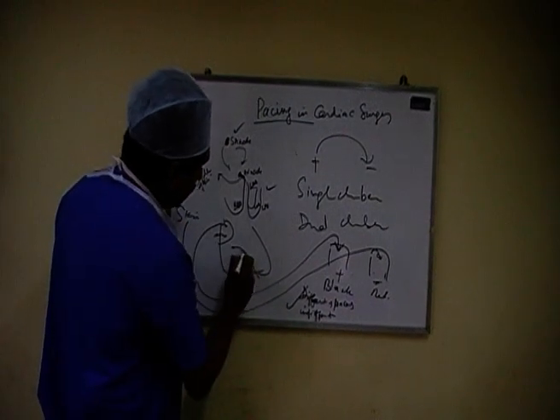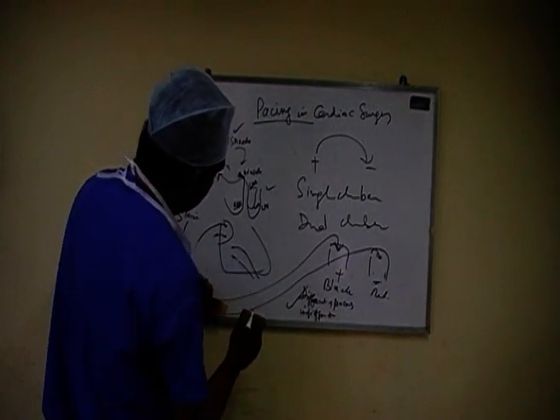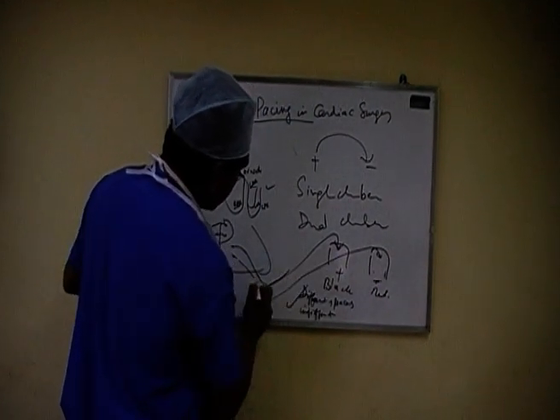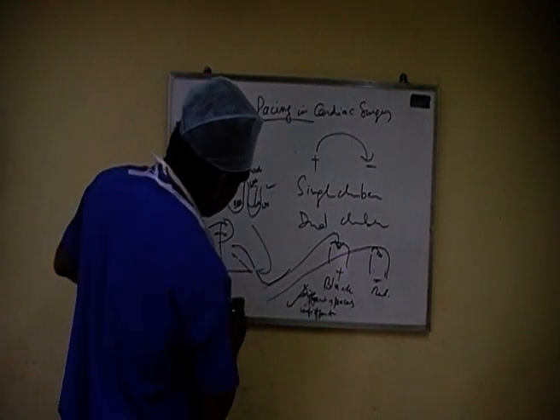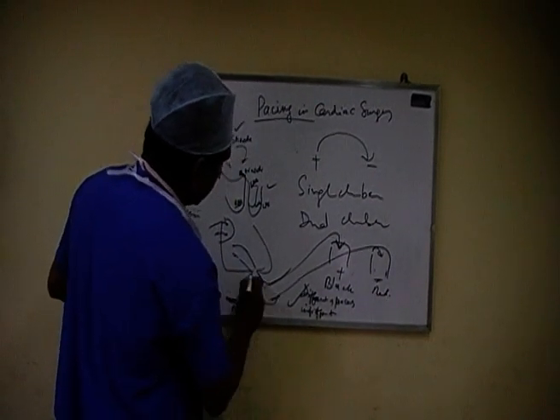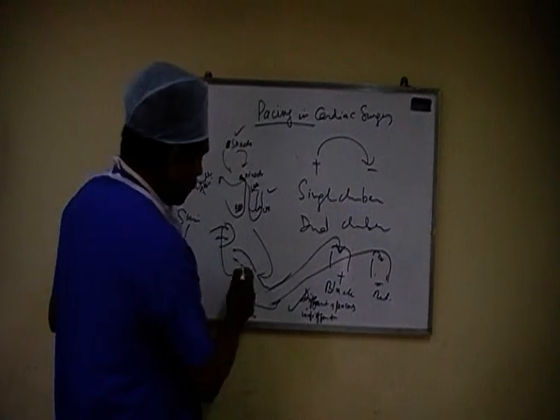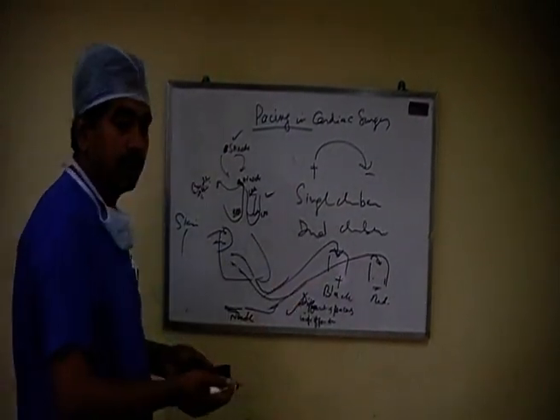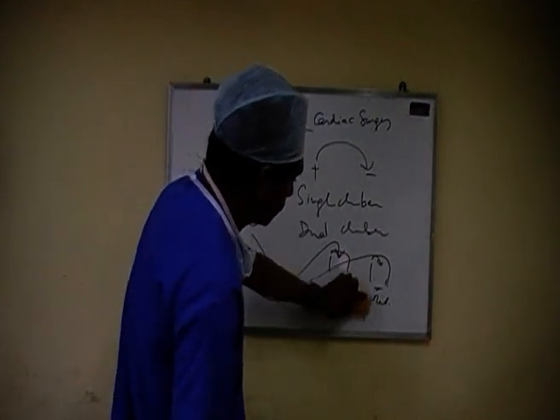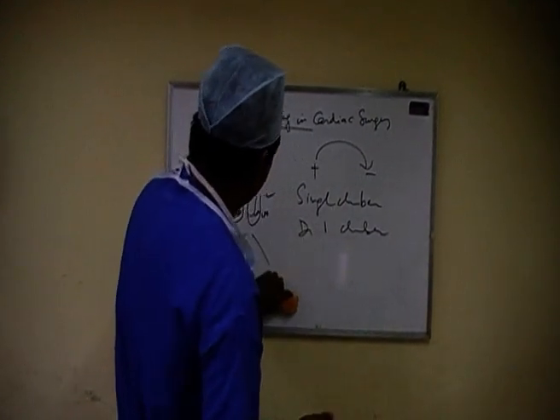If we are having VVI, then there is only one pacing wire. Then what we need to do is the pacing wire that is there on the heart should go to the black, and the pacing wire, or if there is a hypodermic needle on the skin, that will go to the red. If there are two pacing wires on the RV, then you can connect either to whichever lead, and then we can pace the patient whenever needed.